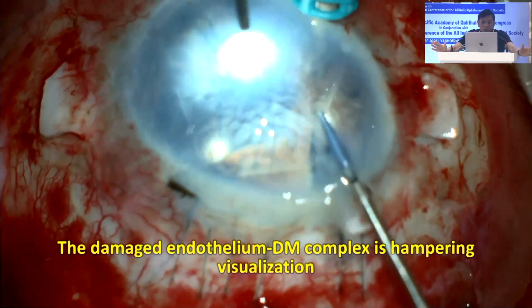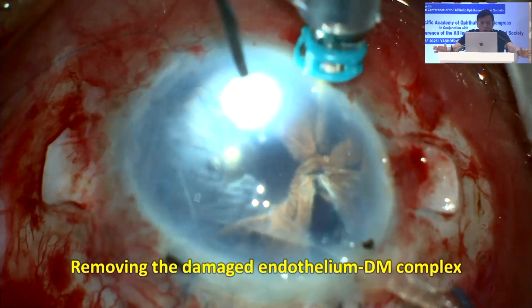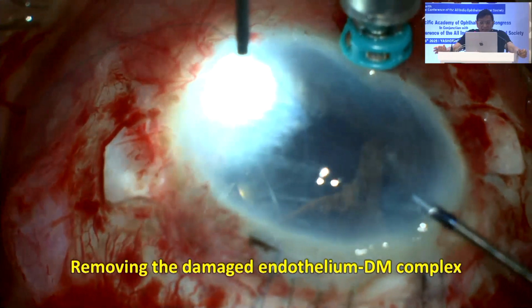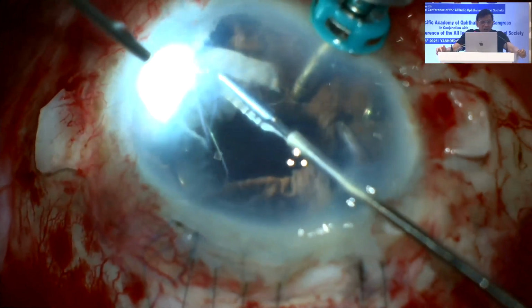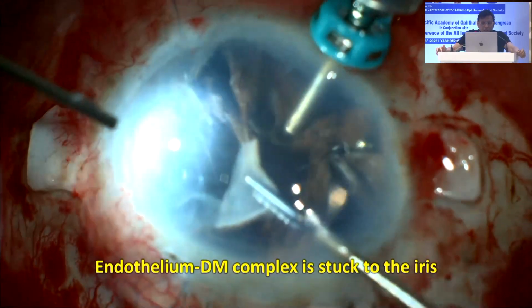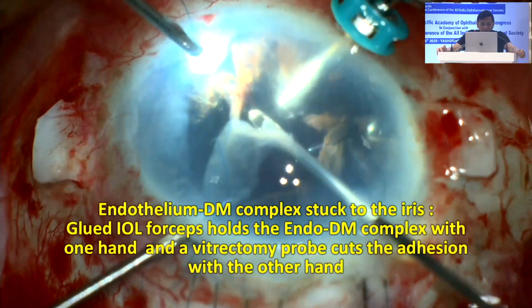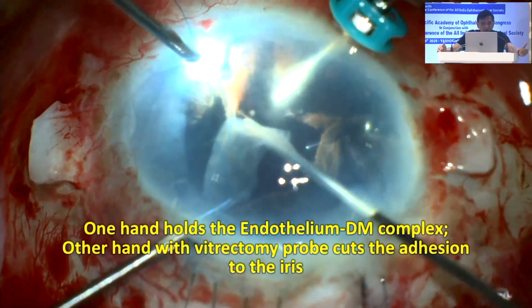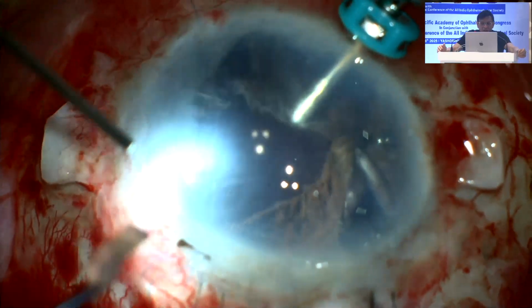So I said, listen, stop. Now let me do one thing. Take off the Descemet's endothelium complex. See how fibrotic the tissue is. It is so bad, this fibrotic membrane, it is even stuck to the iris. See how it is stuck to the iris. So now I hold with one hand the membrane, and with the other hand, a vitrectomy probe is cutting the adhesions between the membrane and the iris. Once that's done, my visualization is improving.